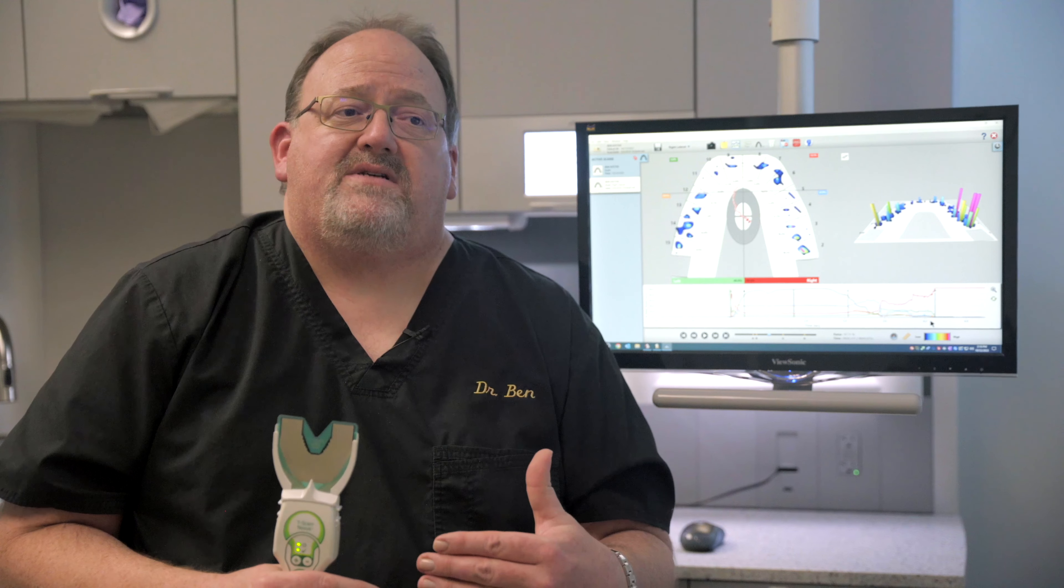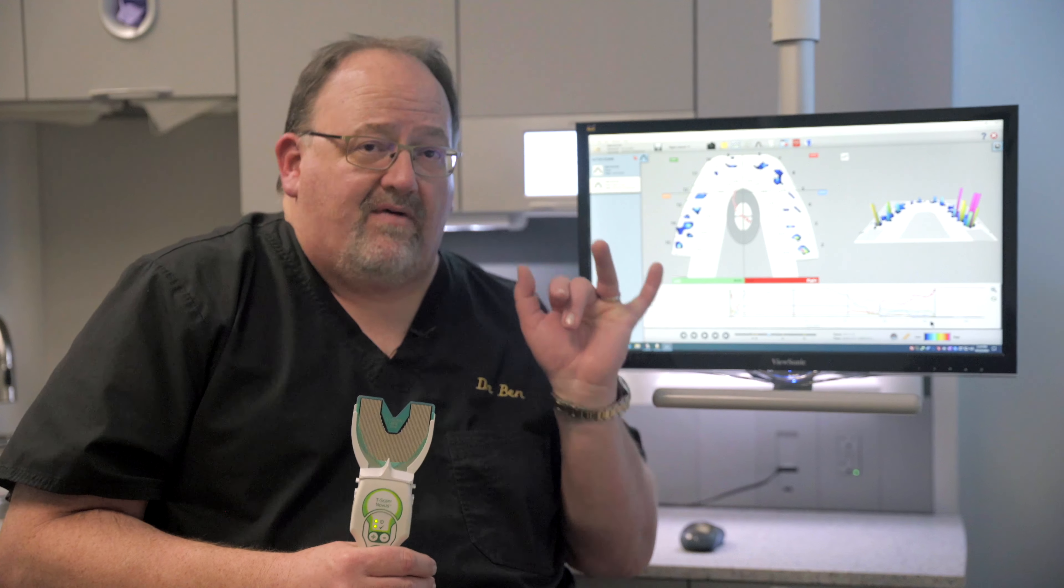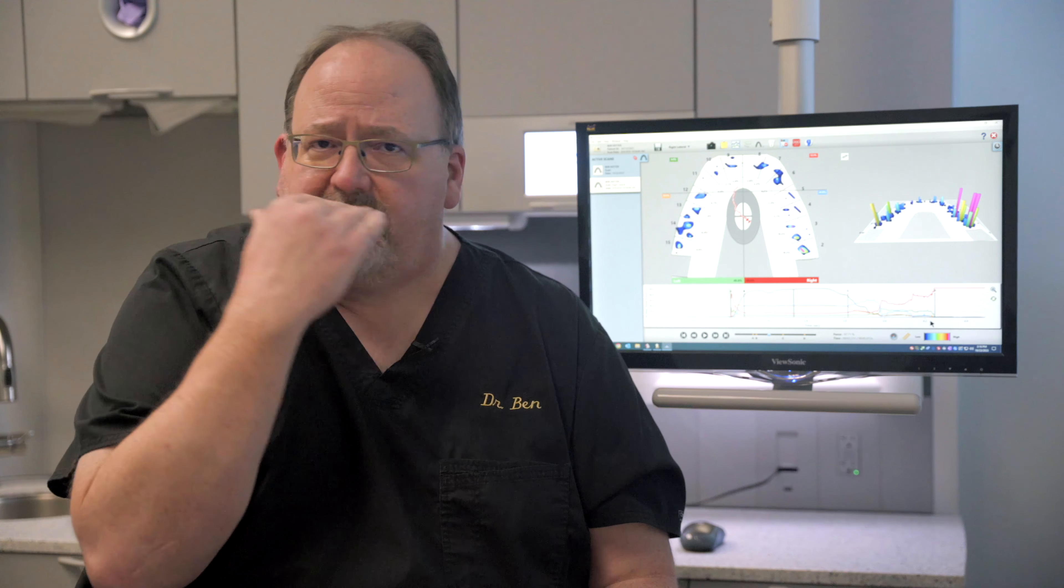Sometimes people fly a long distance to come to this office to have this kind of stuff corrected. Every time you leave, we want to make sure that that bite is where it should be.